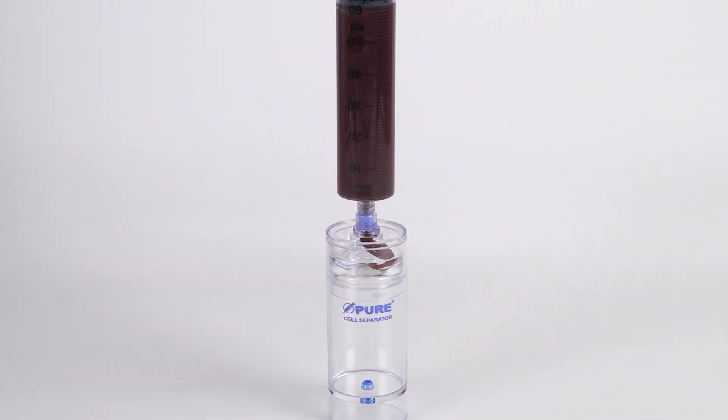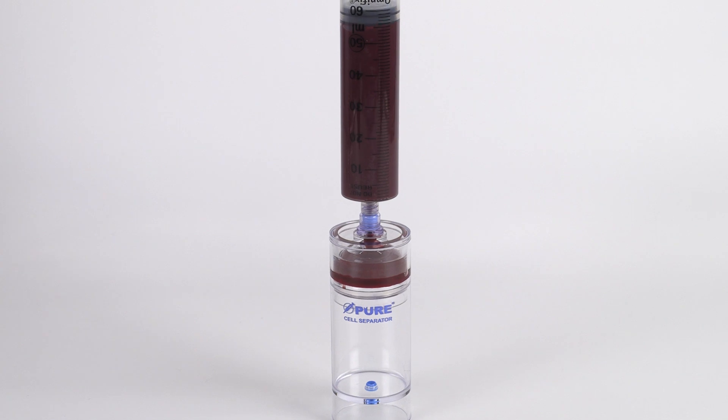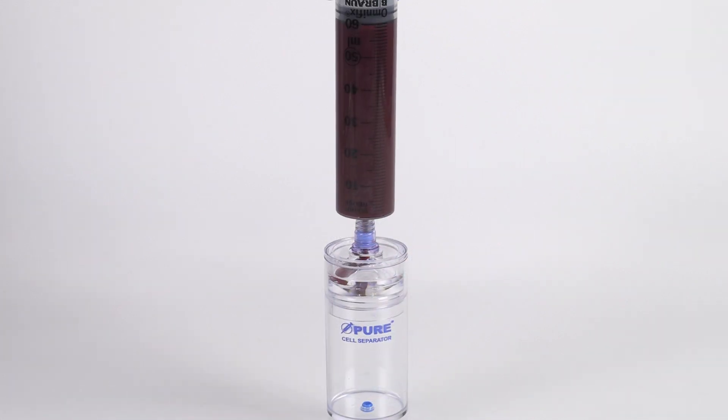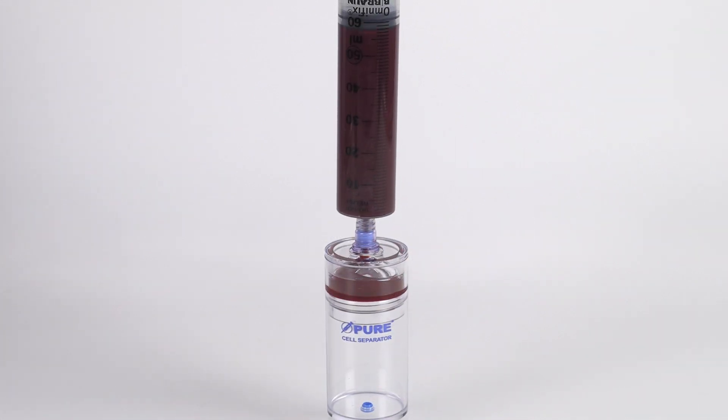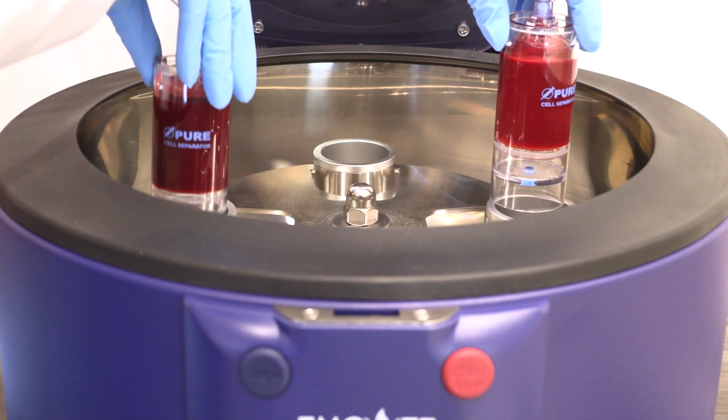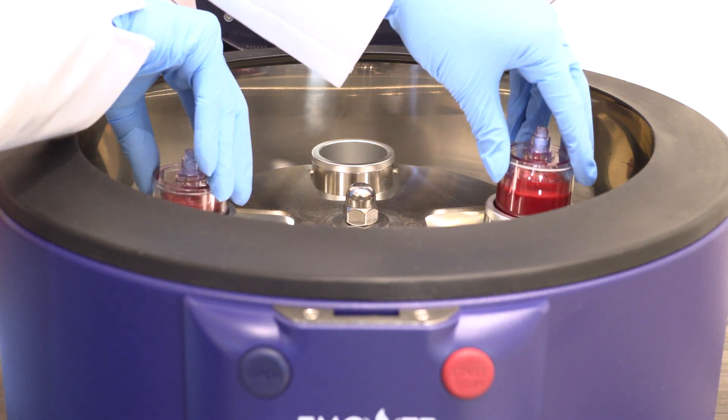Attach the 60-milliliter blood syringe to the needleless port of each separator device and slowly inject the anticoagulated blood. Make sure each device has equal volume, then place both devices in the centrifuge rotor at opposite ends.